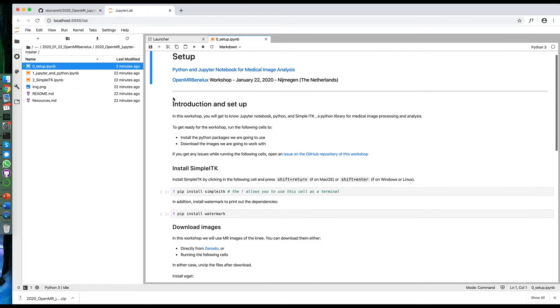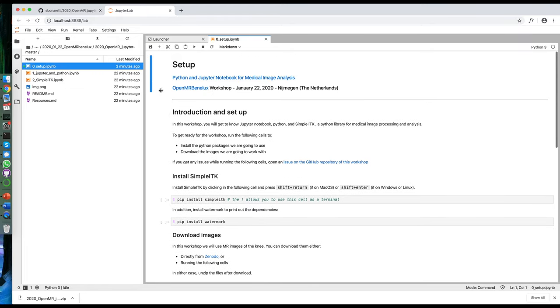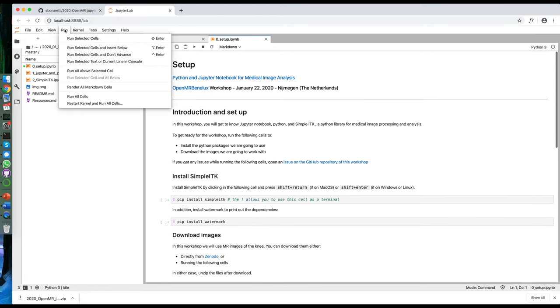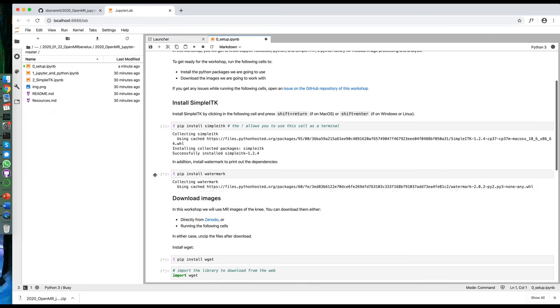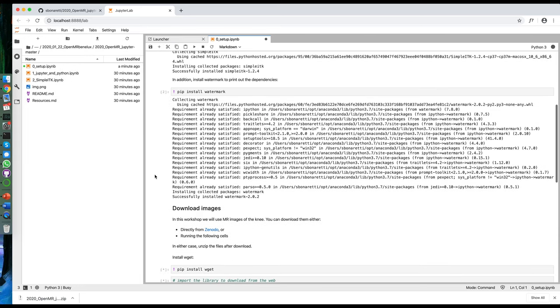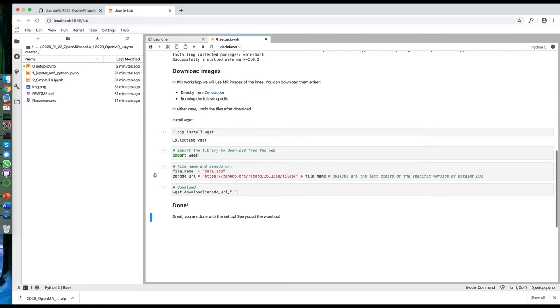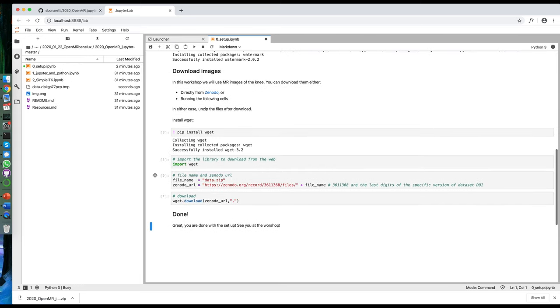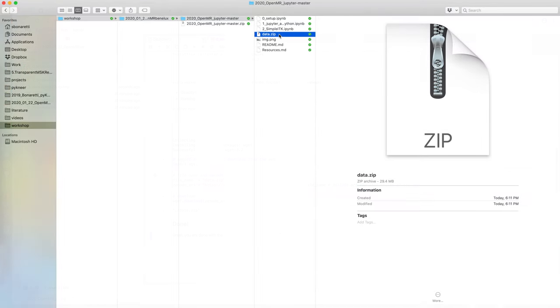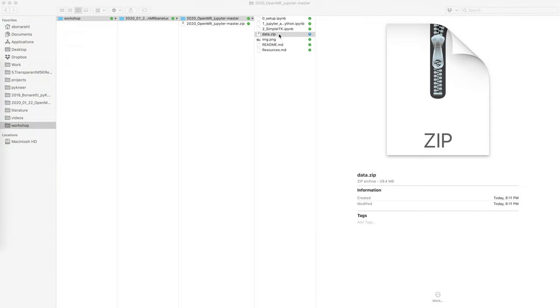Finally, run the cells by going to run, run all cells. Your notebook will look similar to this one. Finally, go to your workshop folder and unzip the downloaded images.